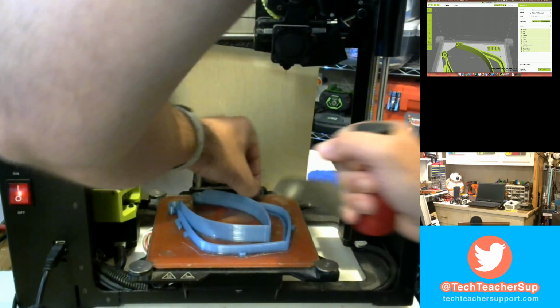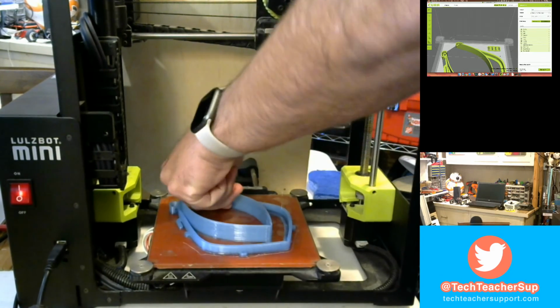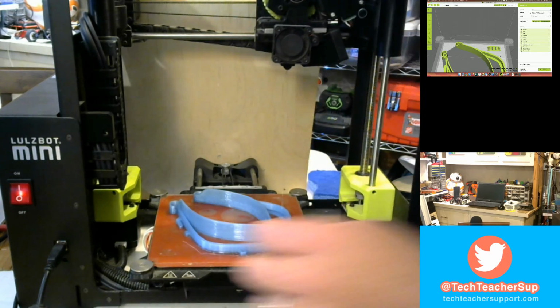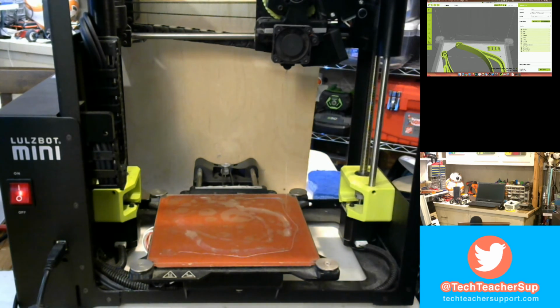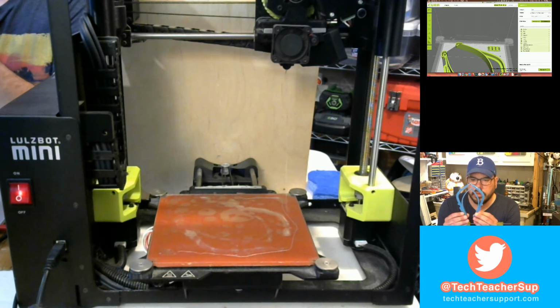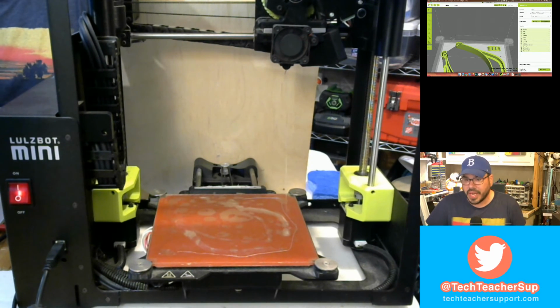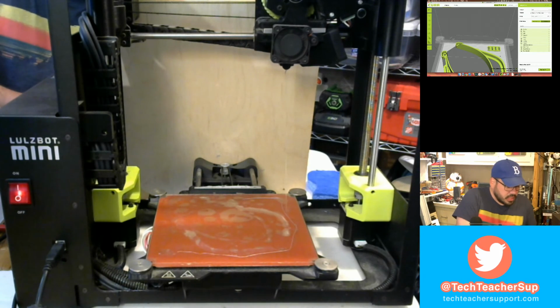Let's get this little guy off. There's two. And then we might be able to just pull this one off. Yep. So we don't even need our tool for that. We can just pull that off, and there we go. Okay? So this is great. We have multiple of these now. We've been printing these for the past few days. We're going to send these all off to IC3D using their donate page. So don't forget to do that.